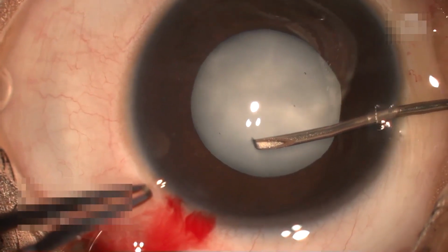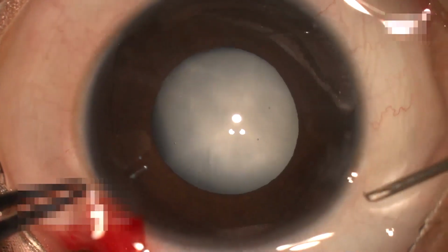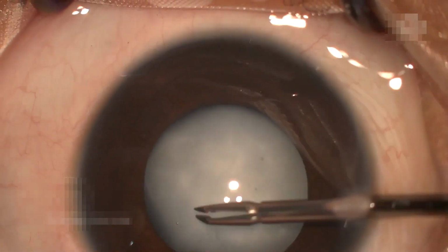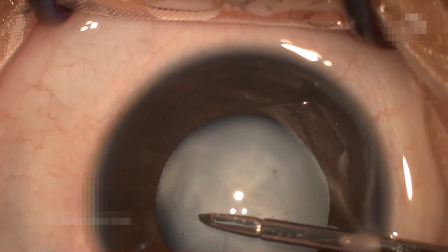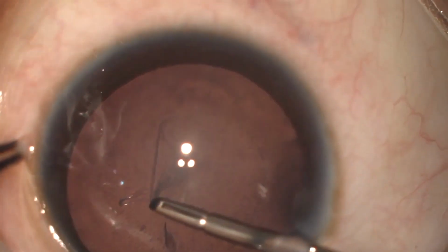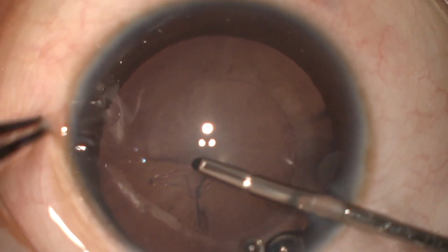In certain situations, with availability of better operating microscopes, even the appreciation of the sheen reflex by slight manipulation of the globe, the course of the anterior capsulorhexis can be visualized and capsulotomy can be completed. And this is known as sheen rhexis. This technique can either be used independently or in combination with other techniques of capsulotomy.